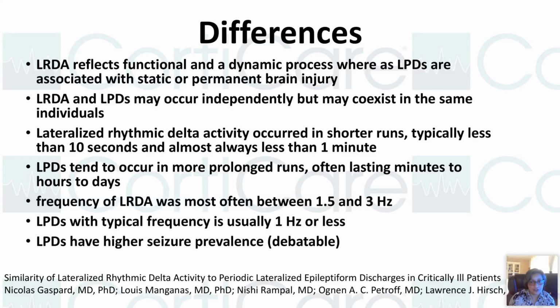LRDA usually occurs in short runs. It may go as high as up to 1 minute, and LPDs can run for minutes to hours to days. The frequency of LRDA is 1.5 to 3 hertz, and LPD frequency is usually 1 hertz or closer to that.